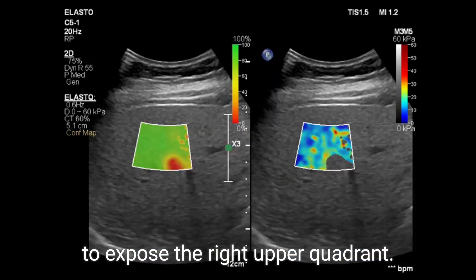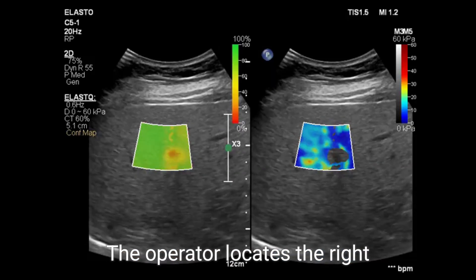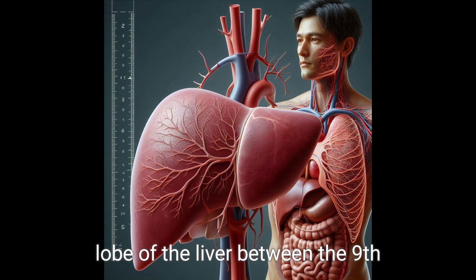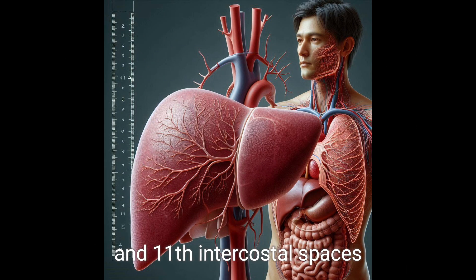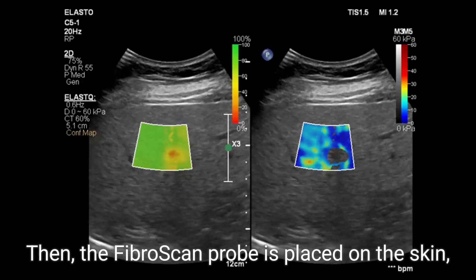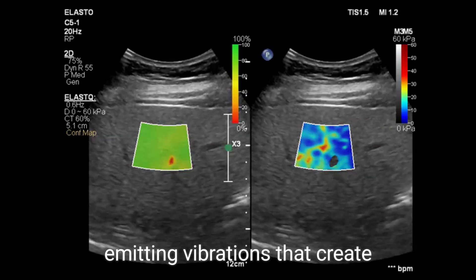During the procedure, patients lie on their back with their right arm elevated to expose the right upper quadrant. The operator locates the right lobe of the liver between the ninth and eleventh intercostal spaces using ultrasound guidance.